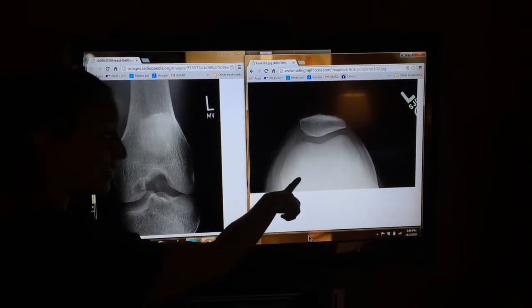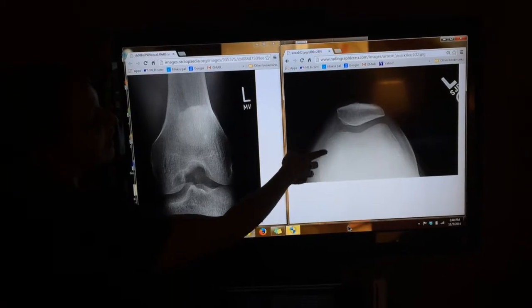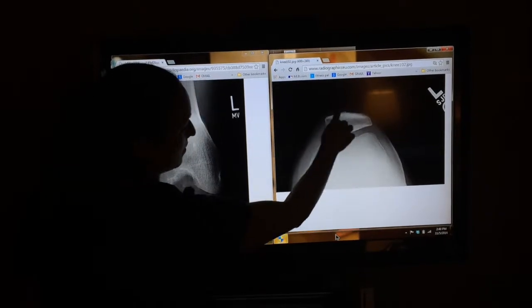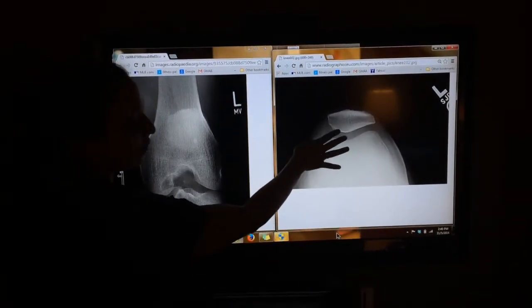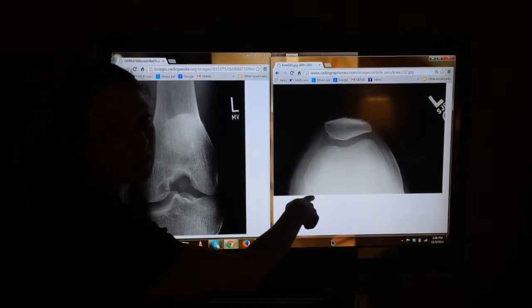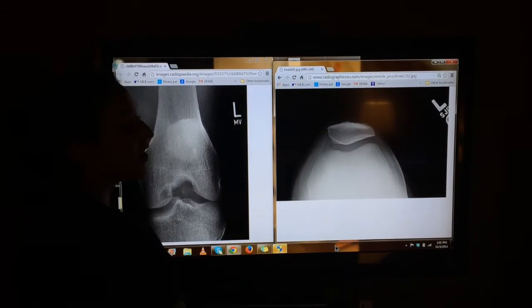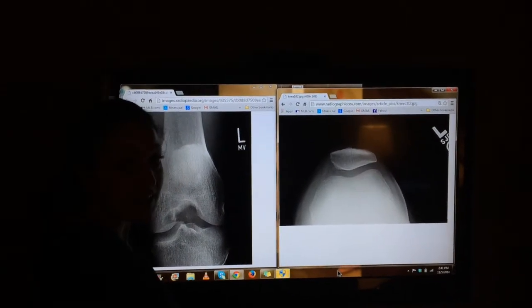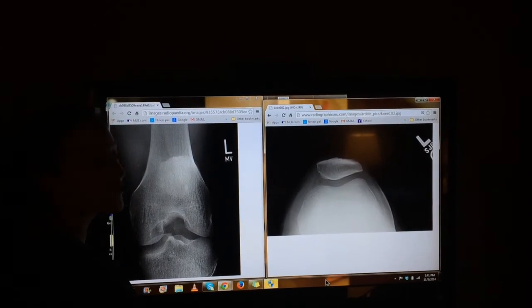All right, for this next view, I have the tangential patella view. This shows the soft tissue, the dome, and it's showing the patellofemoral joint open beautifully all the way through. It's showing the patella in profile, so it looks like it's suspended in air, and my marker's over there showing that it's the left knee. That is also known as the Settegast method. All right, and those are the remaining views.